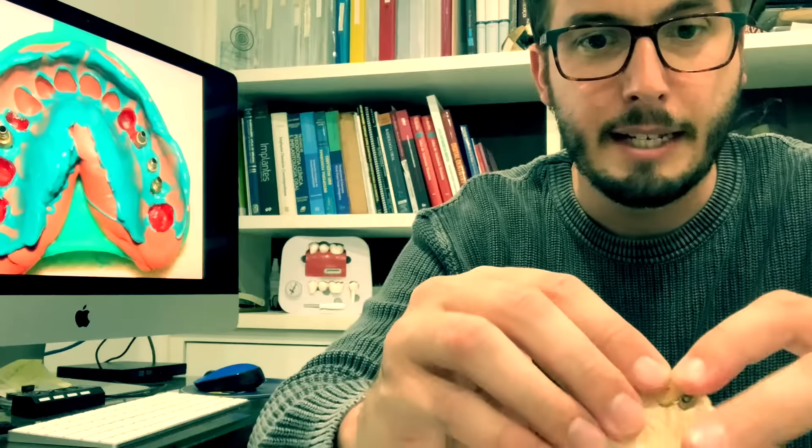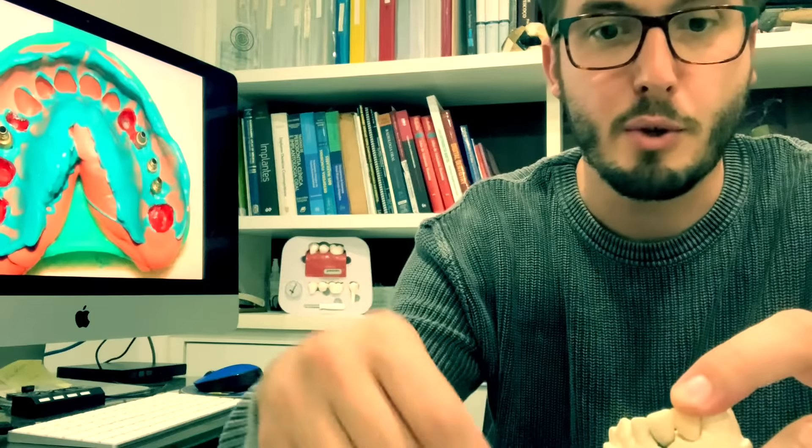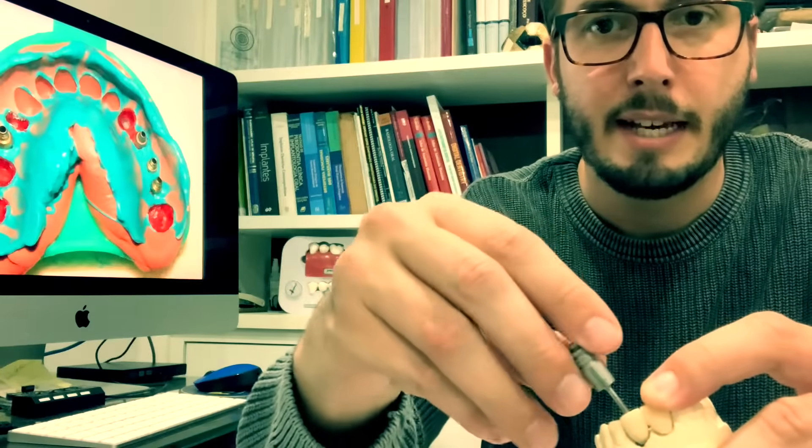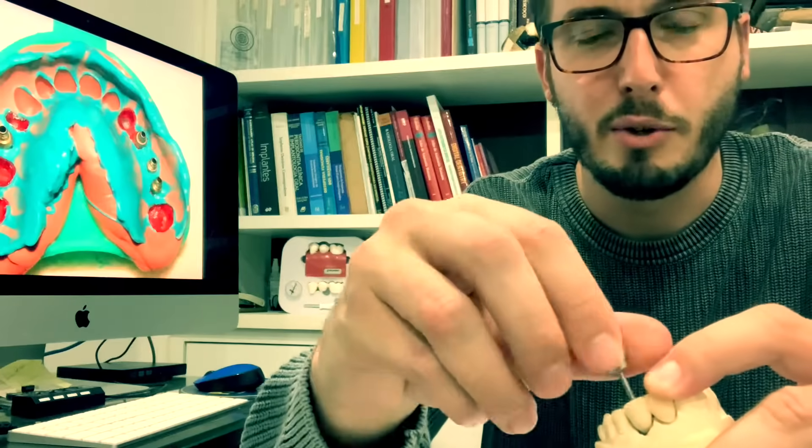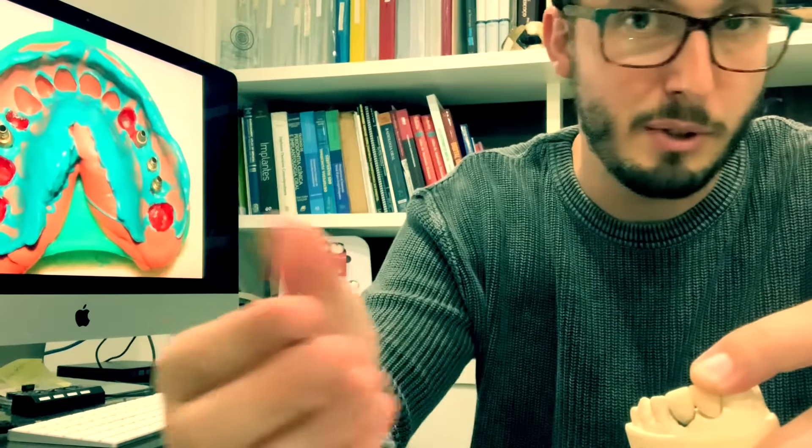And since one of them is screw retained, one of the implants, then of course I can even use the screw of the crown and screw in the crown. And that's what I'm going to do. I'm going to screw the crown and of course I'm going to try in on the patient to see if it's good or not.